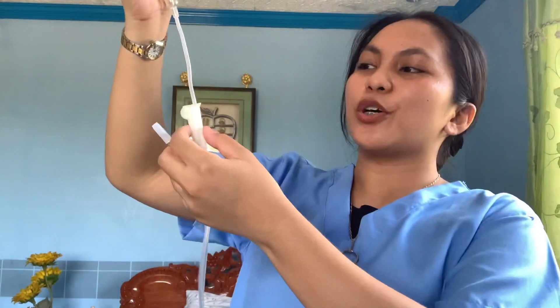Imagine that there is IV fluid dripping on this IV infusion set. After we see the dripping, we're going to hang the IV on the IV pole — let us imagine that there's an IV pole. After that, we're going to adjust and partially fill the container of the IV infusion set. Imagine that this is already partially filled. Next, we're going to prime the IV tubing.